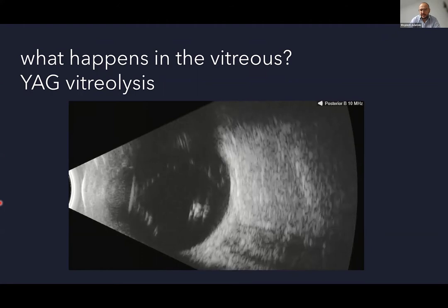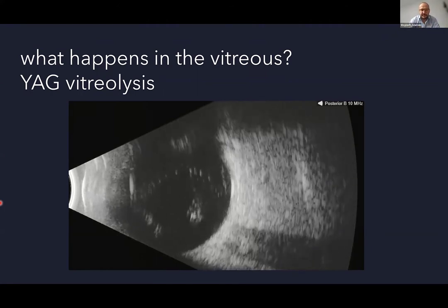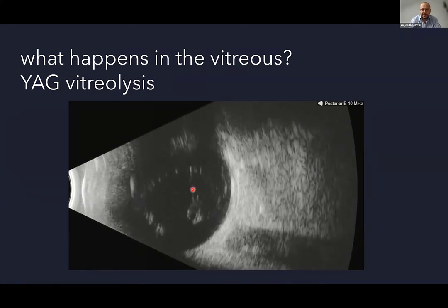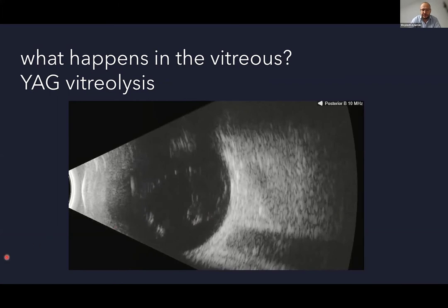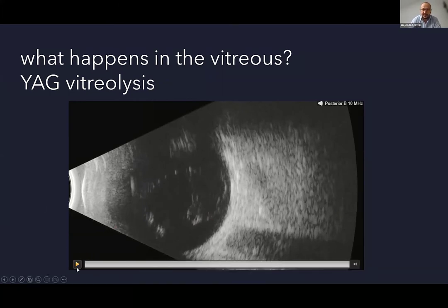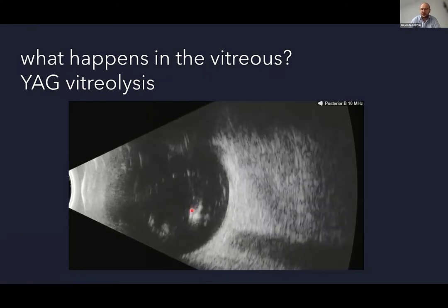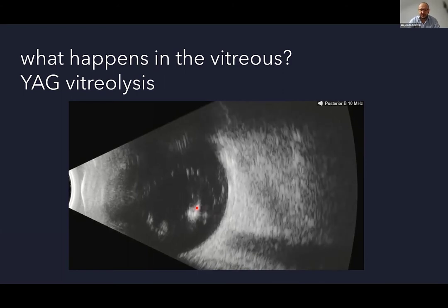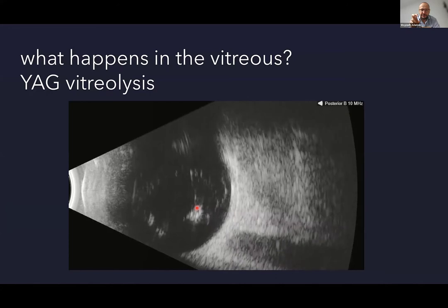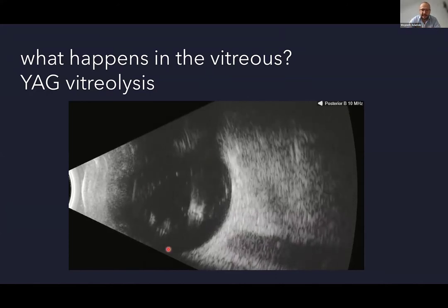The point was to find out how much damage, let's say, because that's not what is really happening, but how much turmoil vitreolysis is doing to the whole vitreous. That was the first idea, to see that for ourselves. But obviously, we also wanted to show the other ophthalmologists, the ophthalmic world, to prove that vitreolysis is really a local process, not really affecting the whole vitreous.